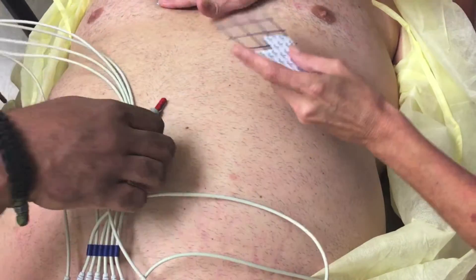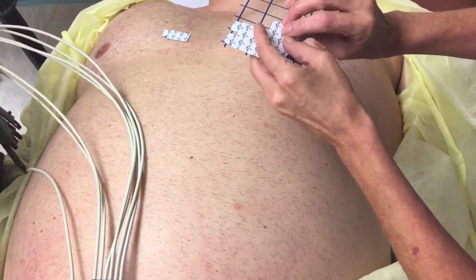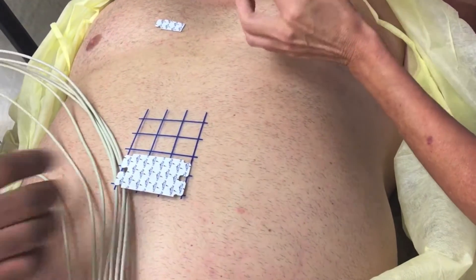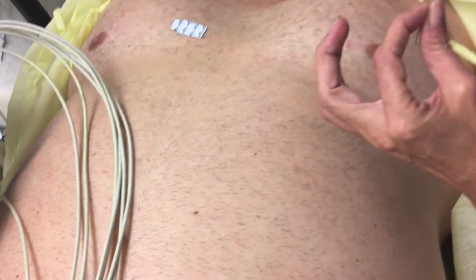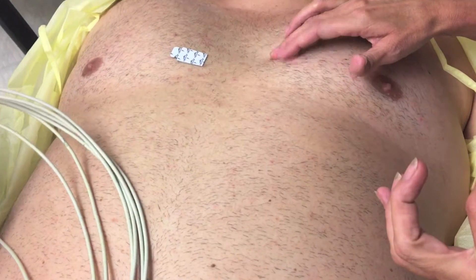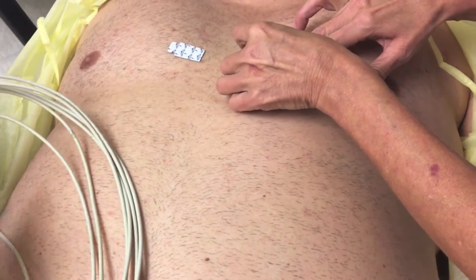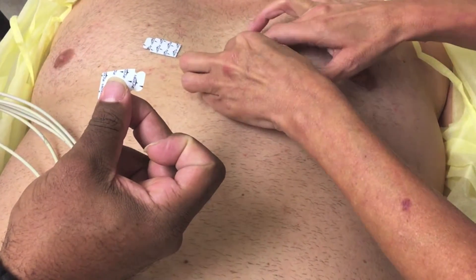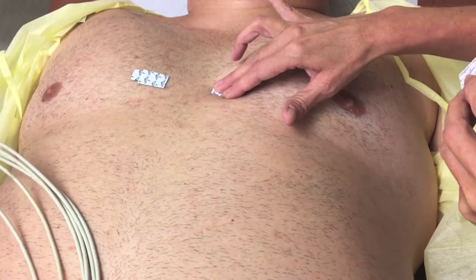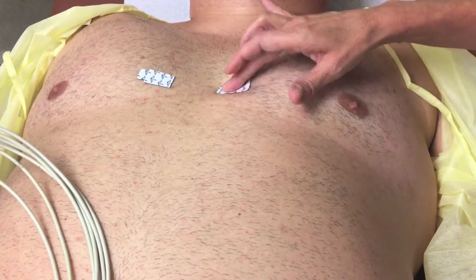That's going to be V1. V2 is going to go to the 4th intercostal space to the left of the sternum. Again, you want to use your fingers and count down from the clavicle: 1, 2, 3, and 4, at the border. Next is V3, and that's going to go midway between V2 and V4.